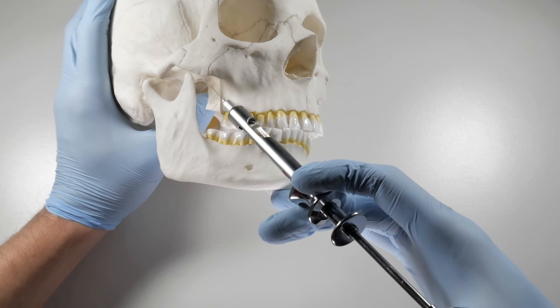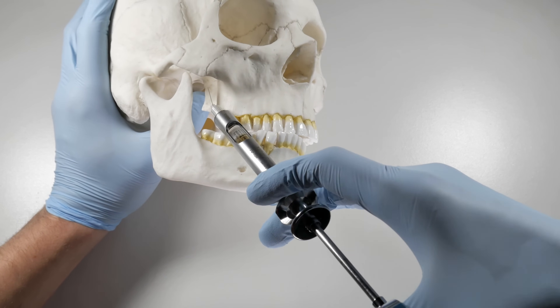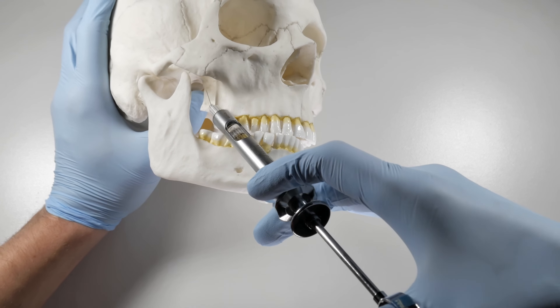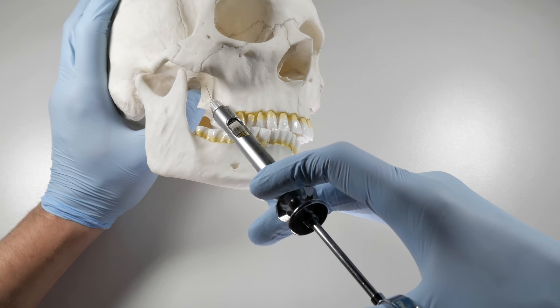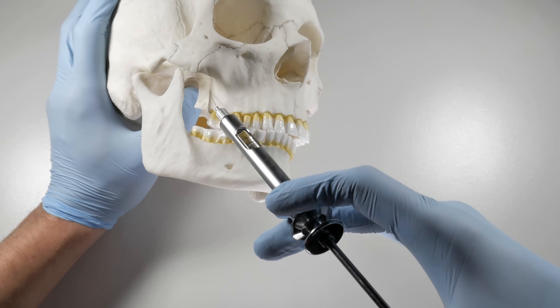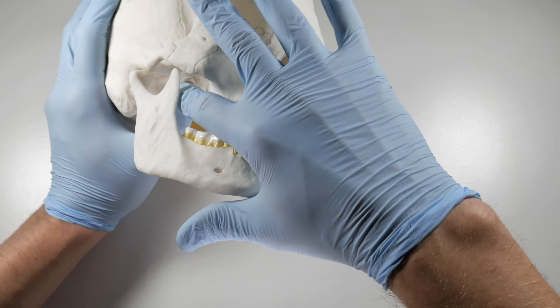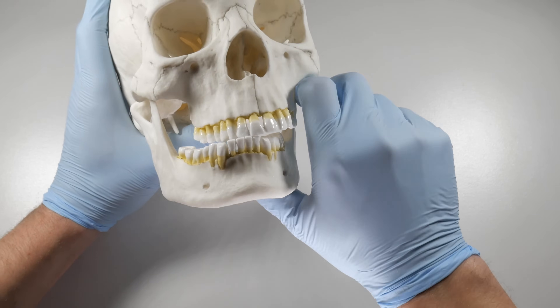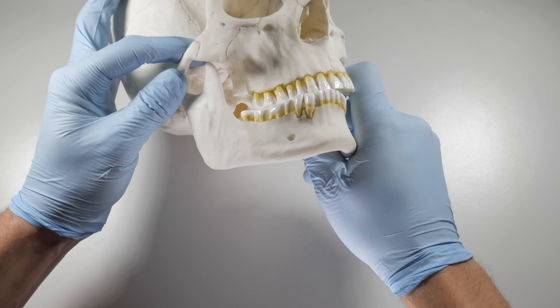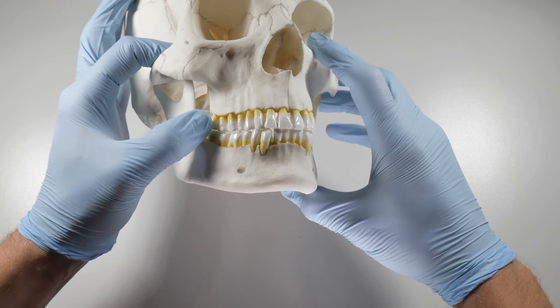You need to aspirate twice in different planes — once in one plane, once in another. If you have two negative aspirations, you can deposit 0.9 to 1.8 mils of anesthetic into this region. This space will accommodate a lot of anesthetic back here, but 0.9 to 1.8 is typically all you need. I'll usually do a full carpule when I'm doing an extraction back here.